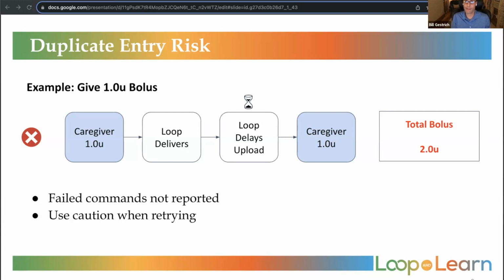And I don't have a rule of thumb, like wait this many minutes, or wait 15 minutes, 5 minutes. I don't have a rule, just because if there's an error, it could be anything. It could take an hour. You just got to use your judgment and do what's safe based on what you see. And I think with practice, as you watch the process of entering commands when your child is in a certain location, you will have a better idea of when it's safe to retry.